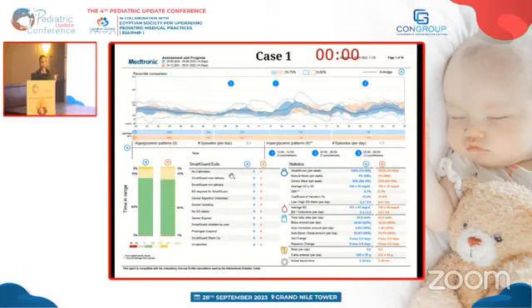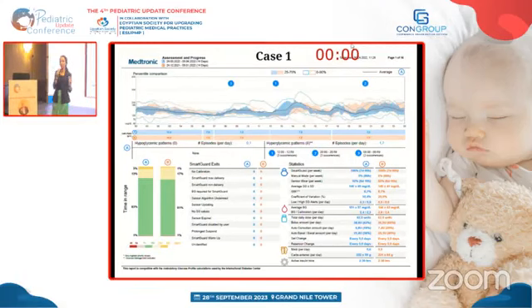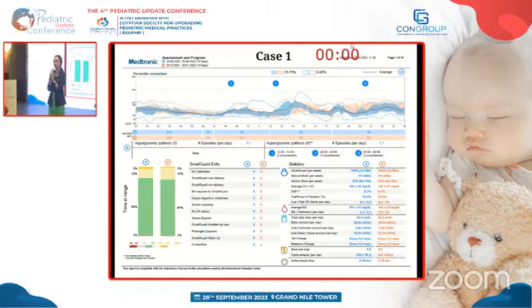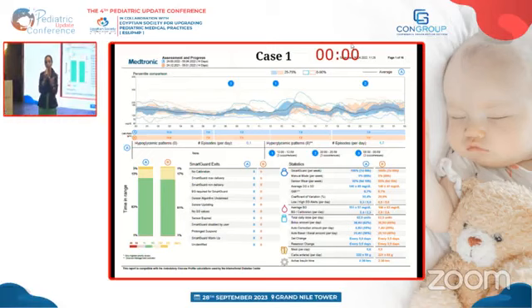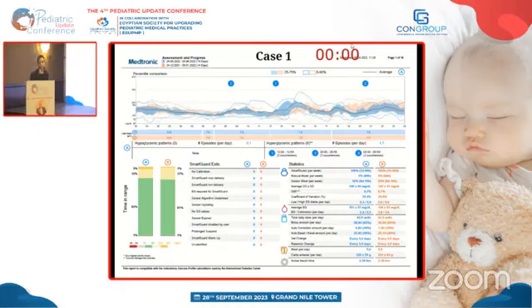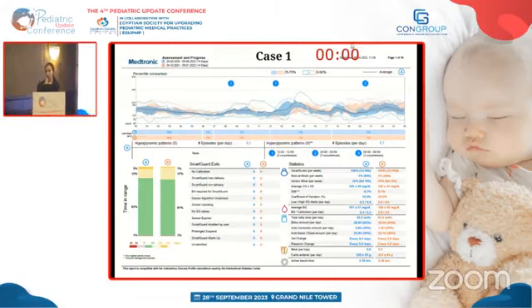هنا في الكيس دي، احنا لما بعمل داونلود بسلكت الرينج، قد ايه البيريد بتاعتي، أنا عايزاها لمدة أسبوع، أسبوعين، شهر، اتنين، أكتر، بختار الفترة اللي أنا عايزاها. تاني حاجة بيختارها السيستم بيقول لي في الريبورت، تحبي تقارني الفترة دي بفترة سابقة؟ لو أنا دلوقتي عايزة أقارن البيشنت بتاعي الأسبوعين اللي فاتوا بالـ previous 2 weeks، ساعتها أقدر أعمل الكومباريزن دي. فهنا البيشنت ده التايم ان رينج بتاعه 83%، الأسبوعين اللي قبلهم 81%، اوكي.